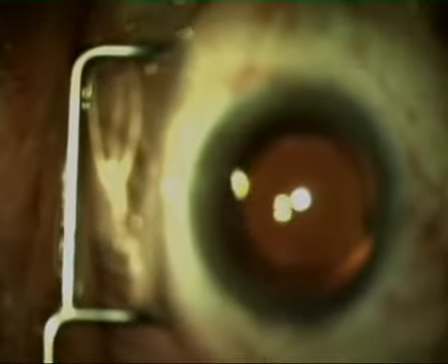If preferred, this may be facilitated by gently depressing the optic to ensure that no part of the IOL is trapped before finally closing the wings and the lens advanced with a slow, continuous and controlled movement of the plunger into the nozzle ready for implantation. Note how the lens moves easily and progressively without any undue resistance.